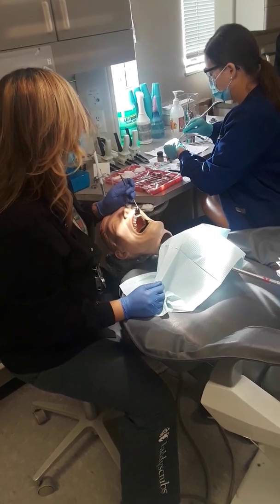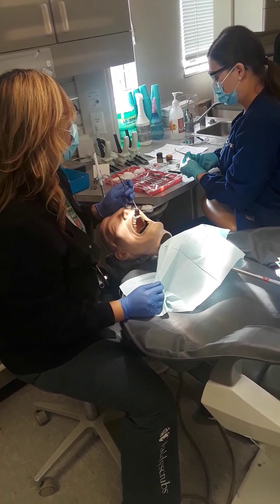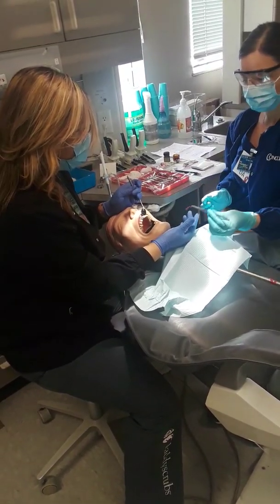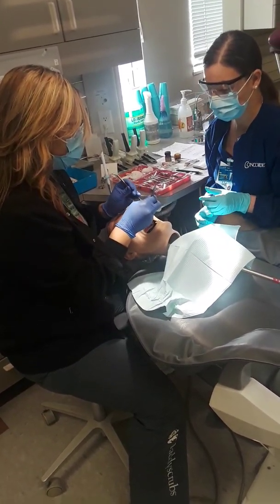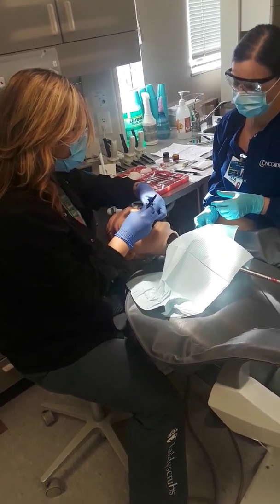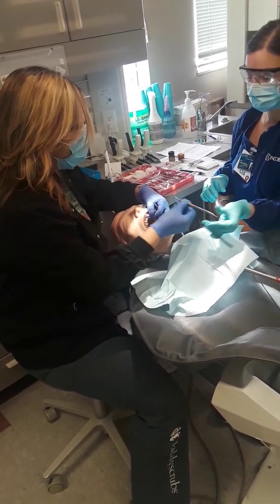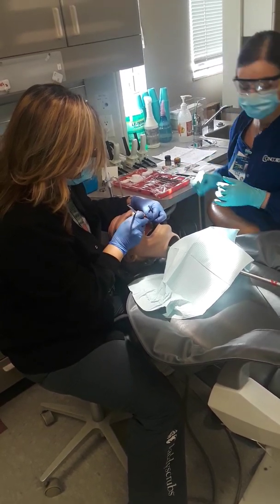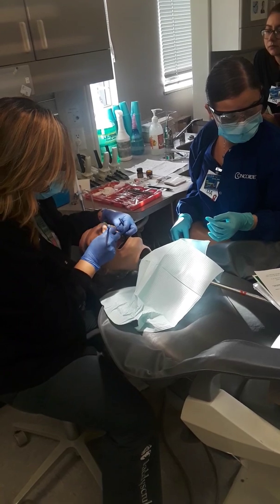She's going to pass it in a certain way. She's actually going to loop my cord so it's ready to go on the tooth. So she has it looped for me. This Hemodent solution doesn't taste very good, so you want to isolate with that cotton roll, don't forget. And you want to be careful when you rinse out the mouth, because then you'll put this nasty stuff on the tongue and your patient's going to be like, bleh.